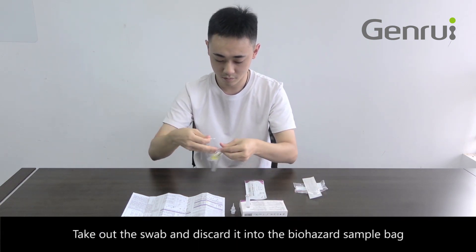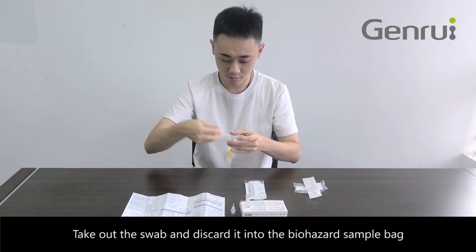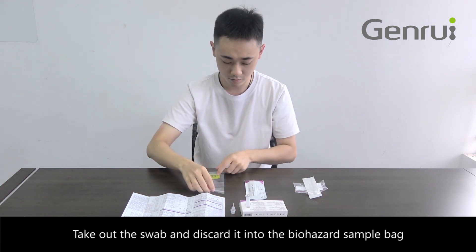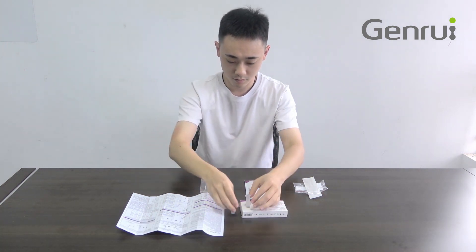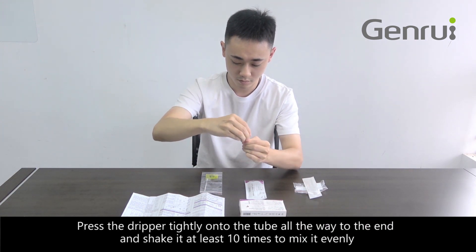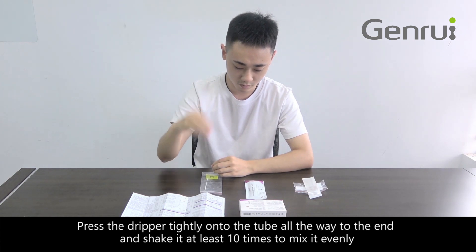Pinch the tube wall to squeeze the swab gently to keep as much liquid in the tube as possible. Take out the swab and discard it into the biohazard sample bag. Press the dripper tightly onto the tube all the way to the end and shake it at least 10 times to mix it evenly.